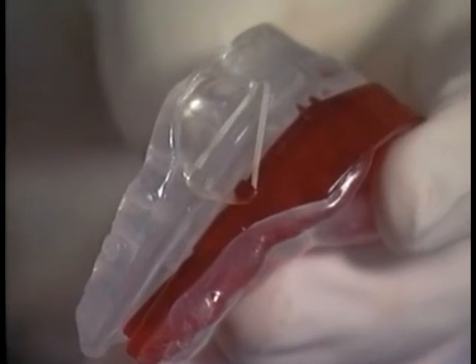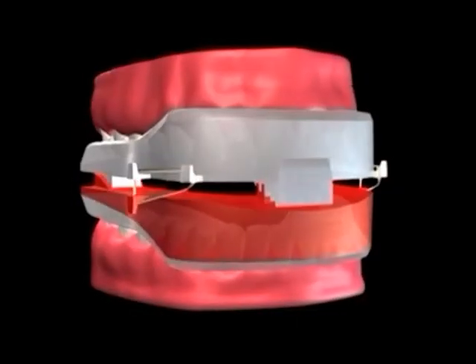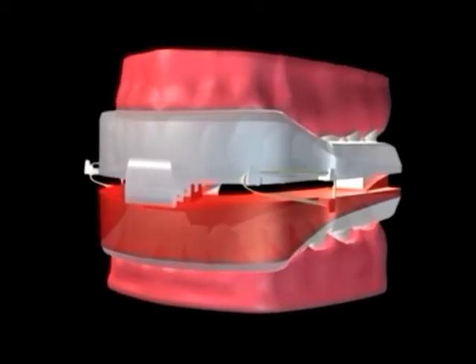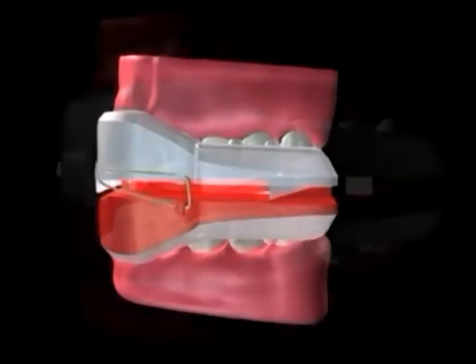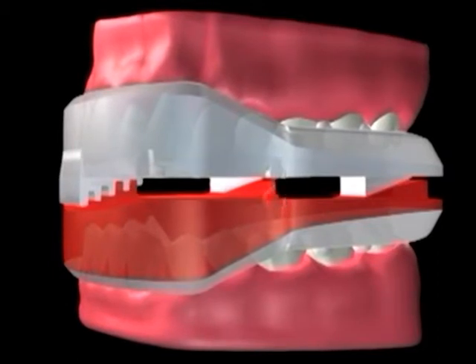The final step in the NORAD fabrication process is connecting the upper and lower components with elastics over the cleats in order to prevent the jaw from retruding during sleep. The lower jaw should be placed in a comfortable, unstrained position using the notches located in the most anterior portion of both devices. Generally this is the ideal position of elastics, but placement is ultimately based on the need for anterior repositioning.